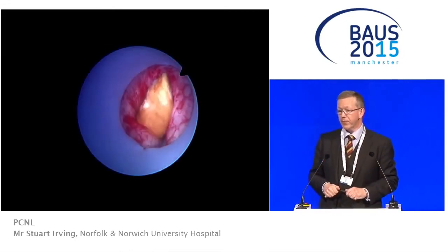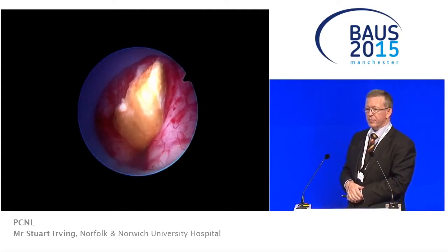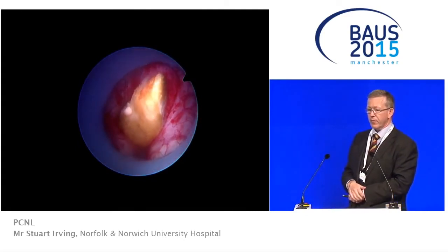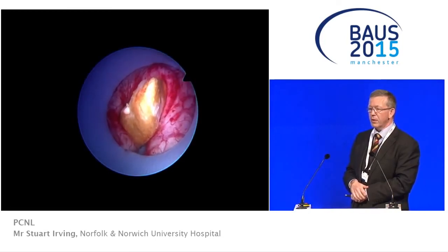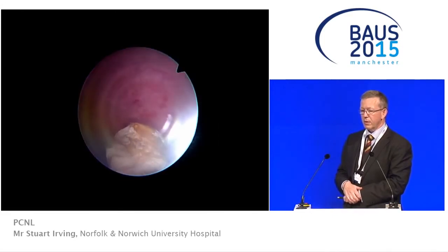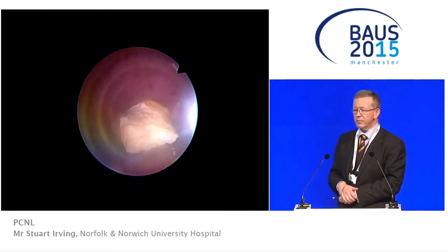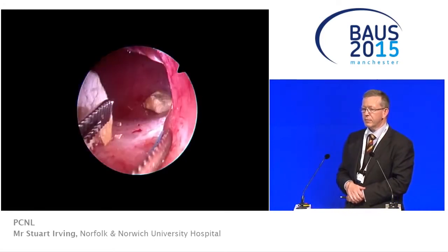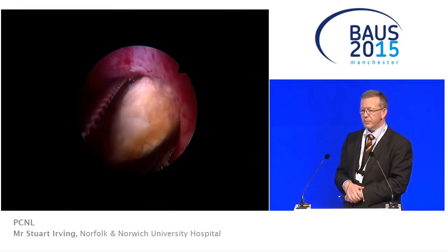Sammy. Yes, hi. Probably when Dr. Monga can correct me, when I visited him in Cleveland, he does most of his puncture on ureteroscopy guidance, and we use the prone position, as you recall. So I find it quite nice when you are sure where your needle is going, and you have the facility to do both retrograde and antegrade.